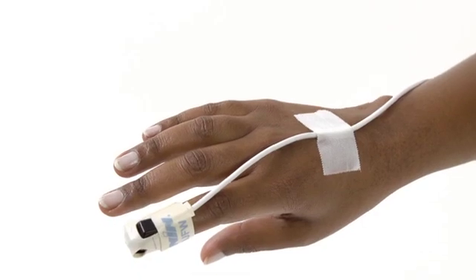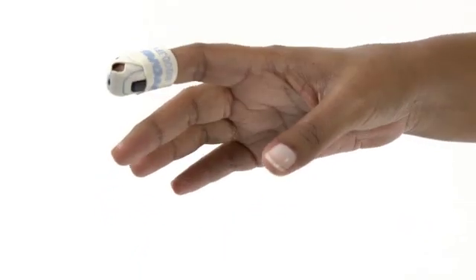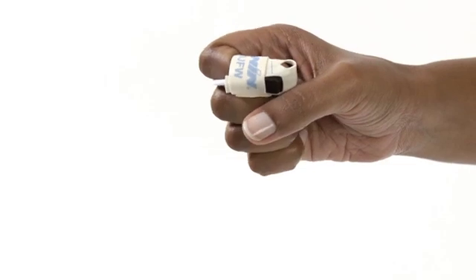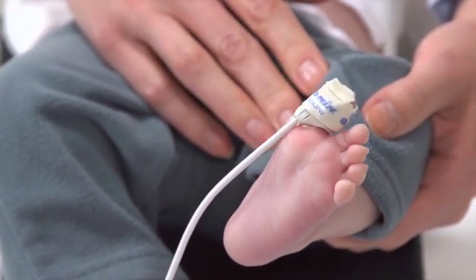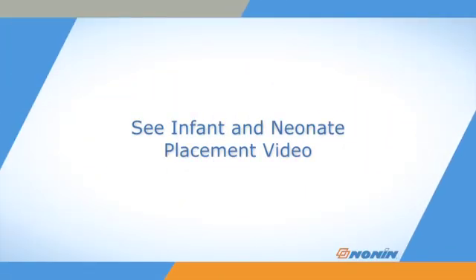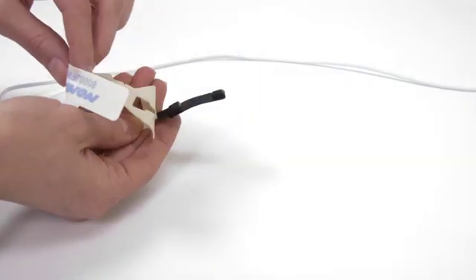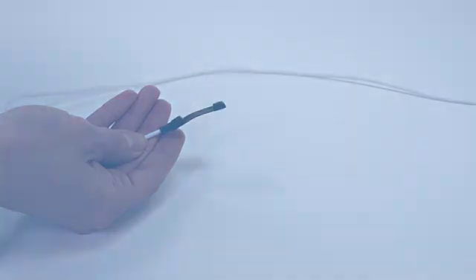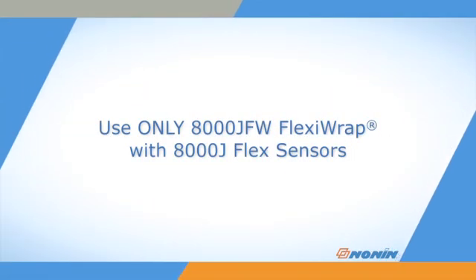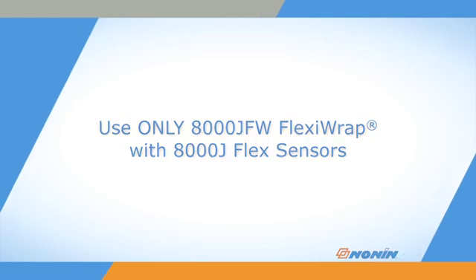The 8000JFW FlexiWrap is designed to secure the sensor in position on the finger without additional tape. Several sizes are offered for infant or neonate use as well. The FlexiWrap is for single use only and should be removed from the sensor and discarded after each use. The 8000J Sensor should only be secured with the 8000JFW FlexiWrap. Other adhesives or tapes will not properly position the sensor and may cause damage to it.